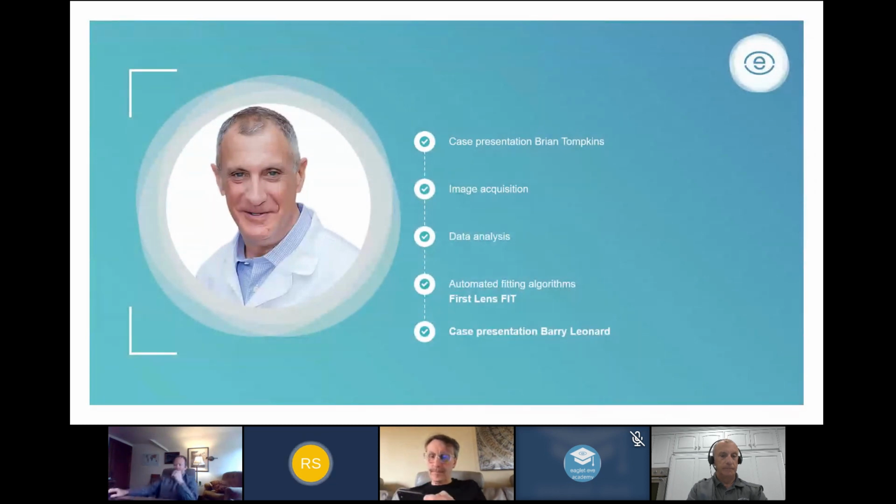David Perko asks, if you're still going to need an OCT to confirm the final tear layer thickness, I understand that the ESP just shortens the fitting time. I think this is a question you can answer, Barry. Correct.